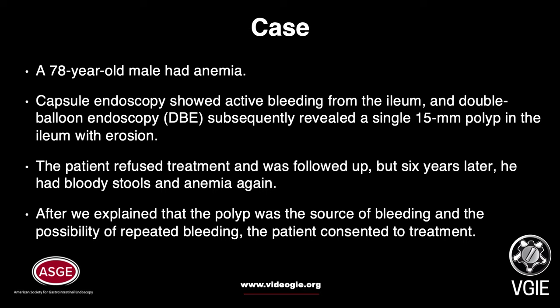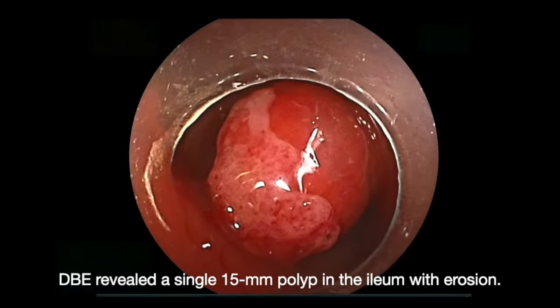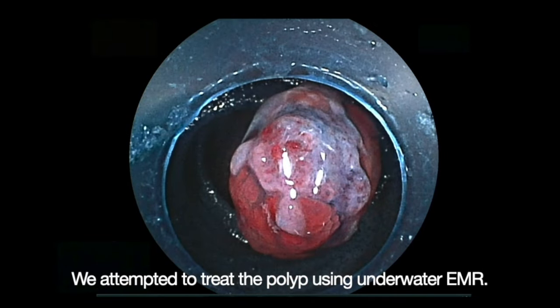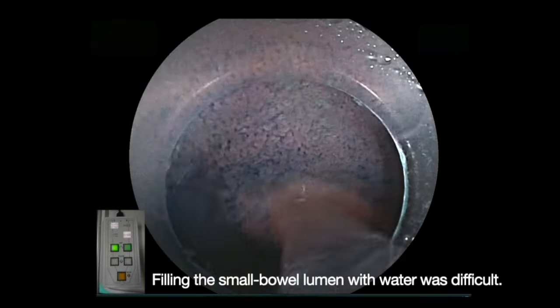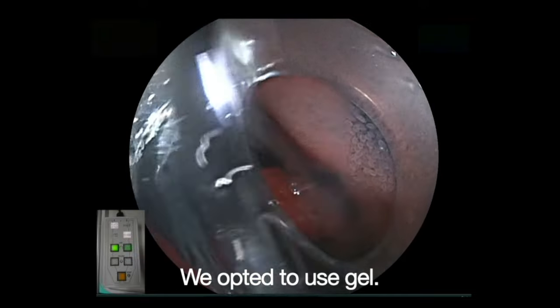After we explained that the polyp was the source of bleeding and the possibility of repeated bleeding, the patient consented to treatment. DBE revealed a single 15mm polyp in the ileum. We attempted to treat the polyp using underwater EMR, but filling the small bowel lumen with water was difficult.